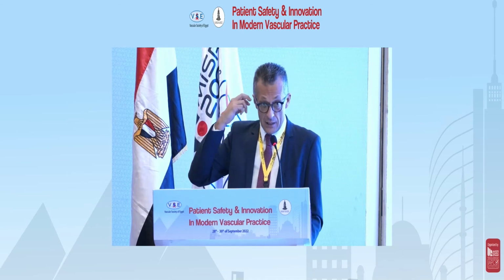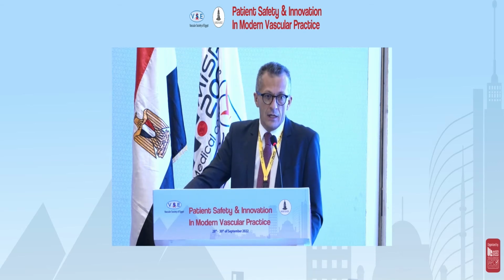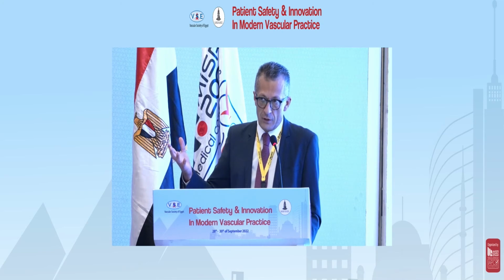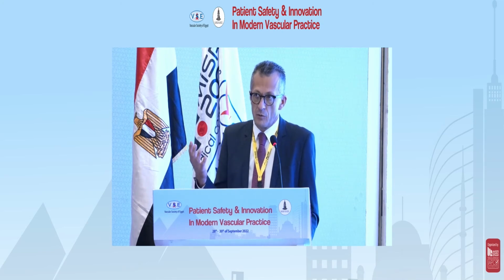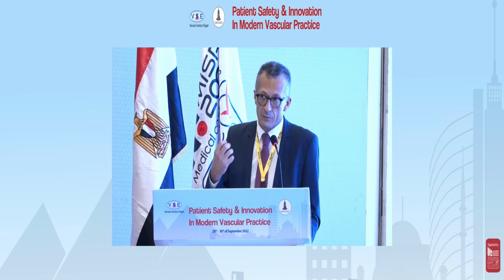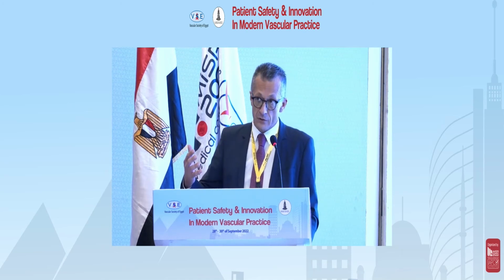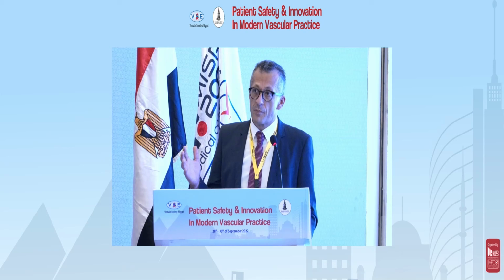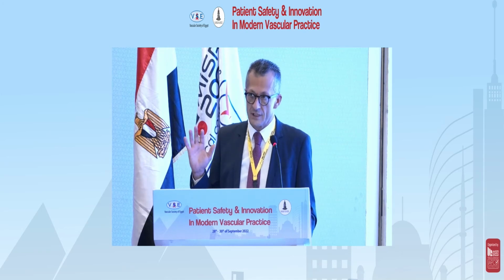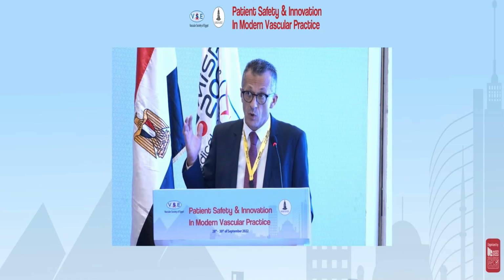After two passages, as I showed before, I didn't remove all the thrombotic material, but probably the fragmentable material. The residual material around the previous endoprosthesis was a hard material, and then I performed the relining. To perform a predilatation, I think there is a risk of distal embolization. This is the reason why I don't like it, also when I work in antegrade.